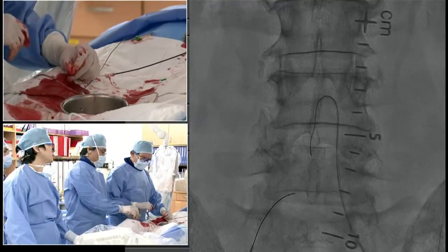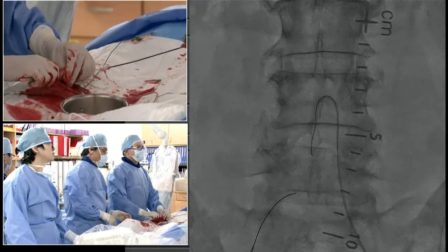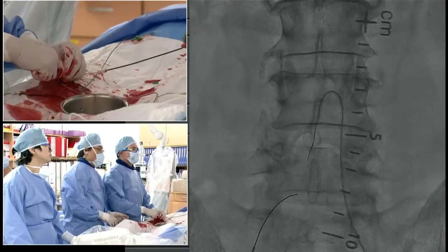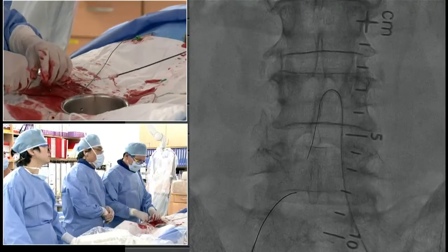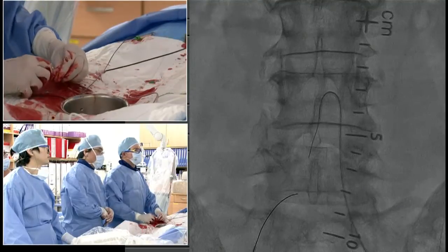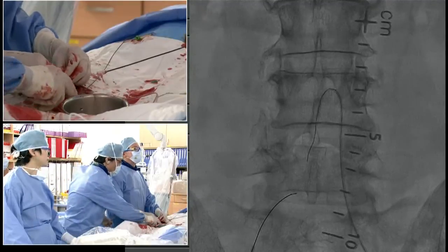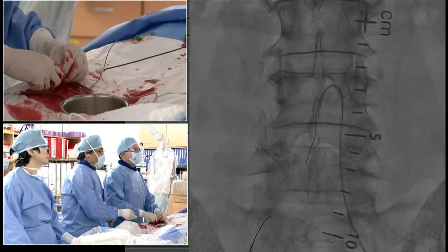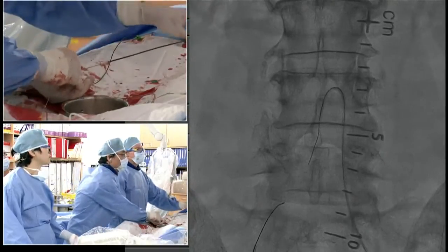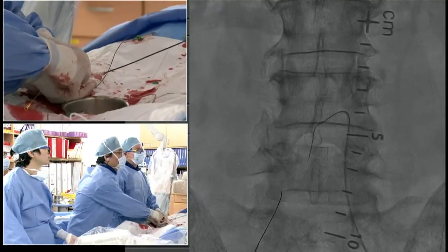Okay, let's get that torquer up here. I have to say, with the availability of reentry catheters in the U.S., I rarely spend too much time on this type of attempt. So if the wire goes easy, then fantastic. If it doesn't, then we can use a reentry catheter from below and finish the procedure fairly quickly. And if you do the procedure carefully, the risk of vessel rupture or perforation is extremely low, even when you are subintimal.